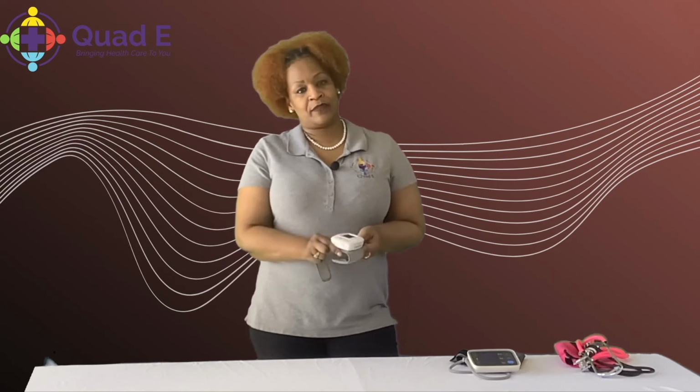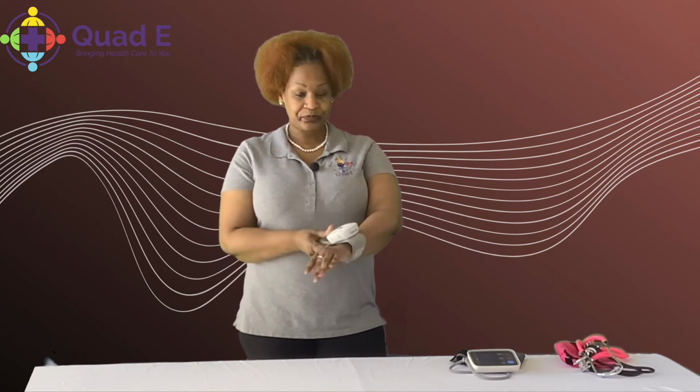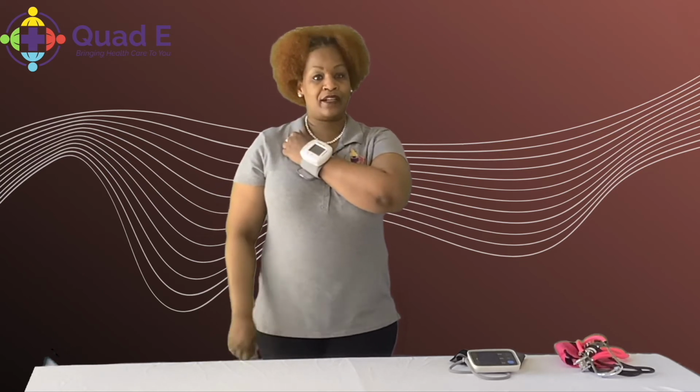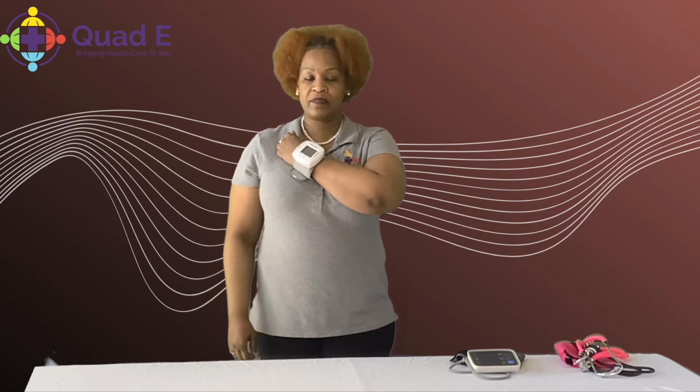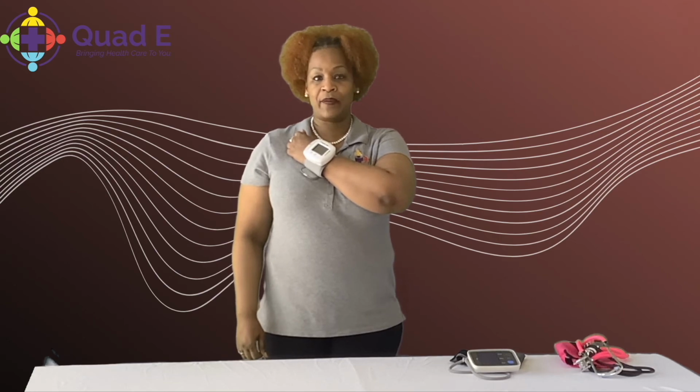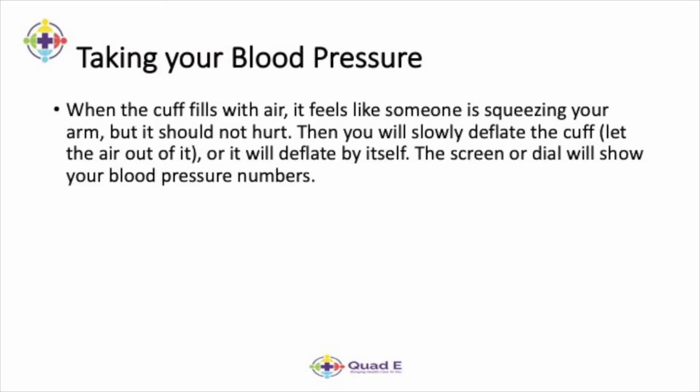So how to use this one? You want to put it on your wrist, okay? Make sure you're following your directions. This one, you want to place over your heart. Before you press the start button, you want to place it there because we don't want to move, as it might throw the reading off. Then you press the start button, get comfortable, and breathe normally, okay? And once it deflates, you'll have your number.